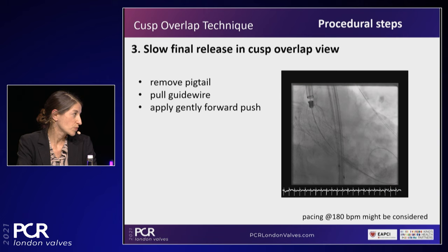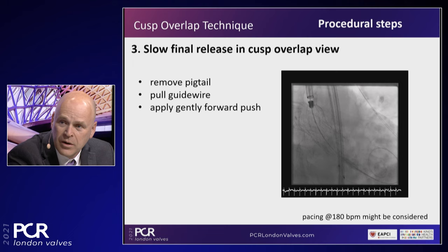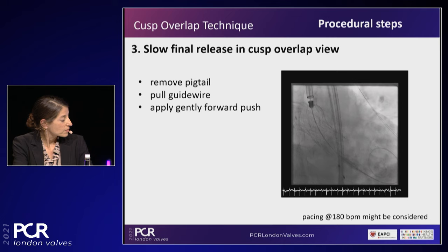I join you here. And actually, we don't pace at the end, but we do it very, very slowly. Yeah. We're very careful, about 1/8 of a turn at a time, and I think that's the key, and it's very stable. What do you do? No, mixed between the both. In the majority of cases, we never pace at that phase, but sometimes we do, and my partner Didier loves to do that also.